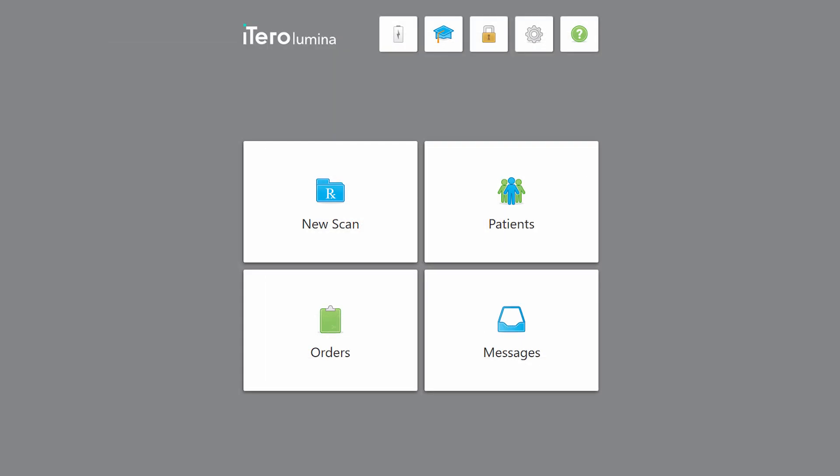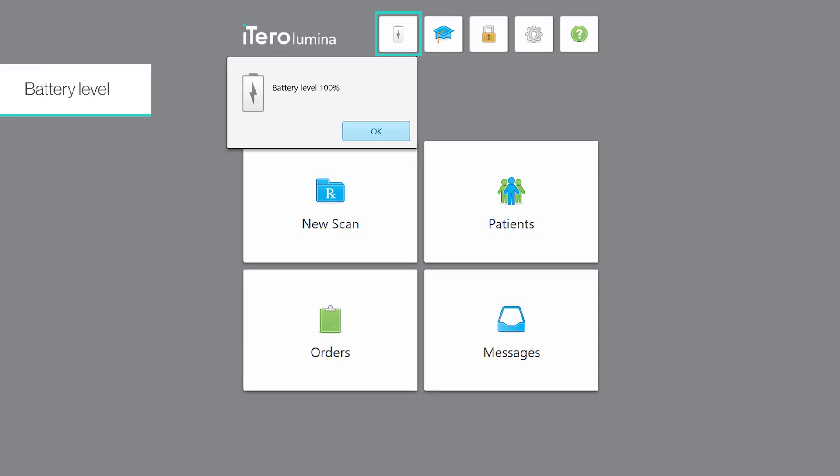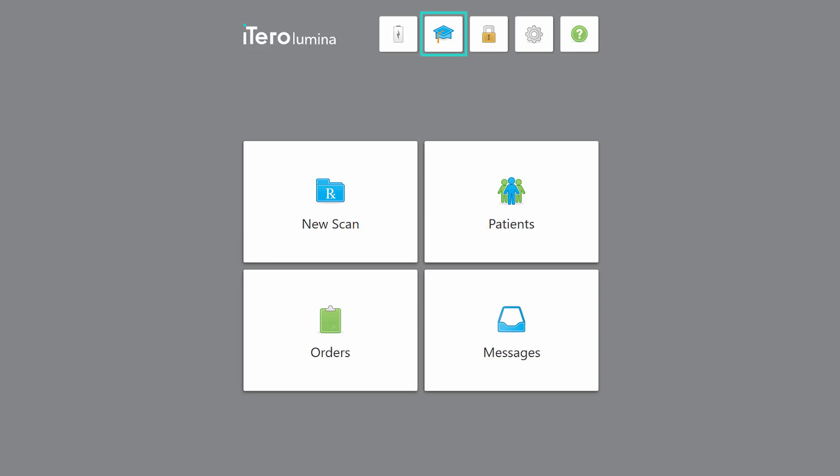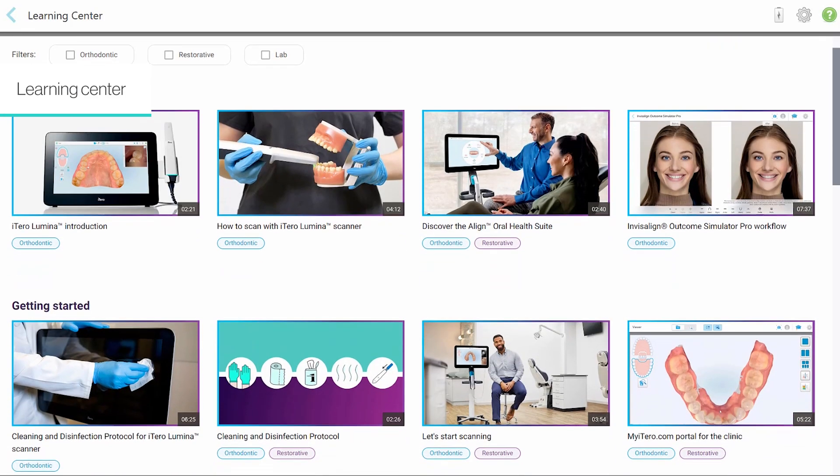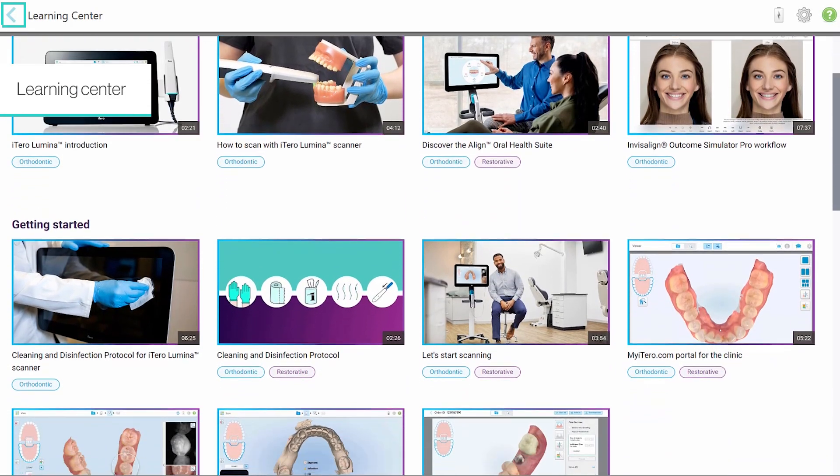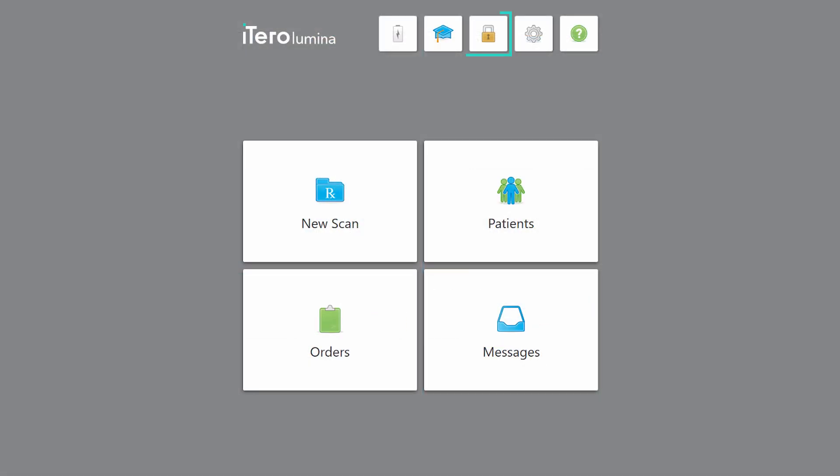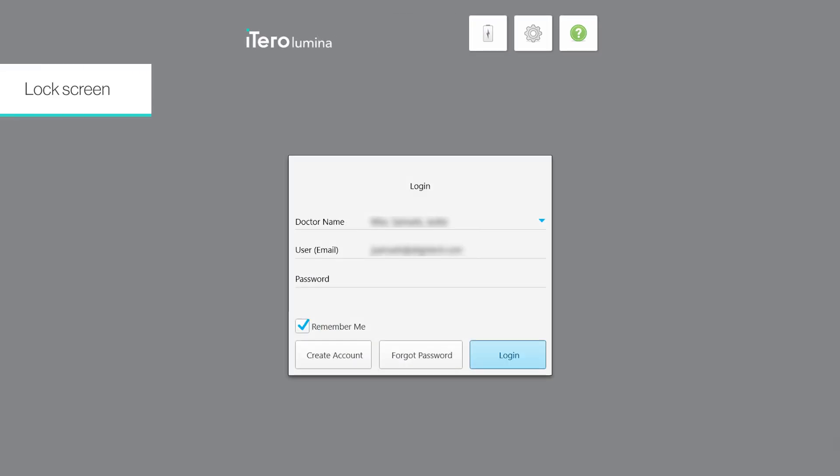Now let's review the upper bar. Tap the battery icon to view the battery level. Tap the Learning Center icon to access the tutorial video library. Tap the lock icon to lock the scanner when it's not in use, or to switch users.